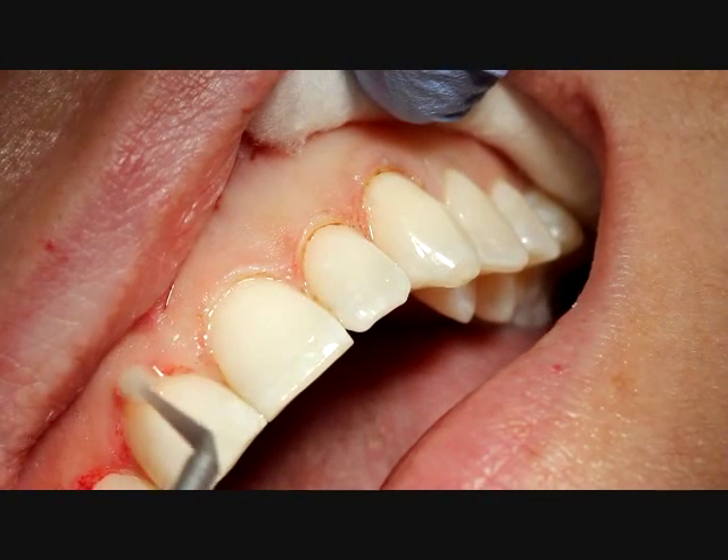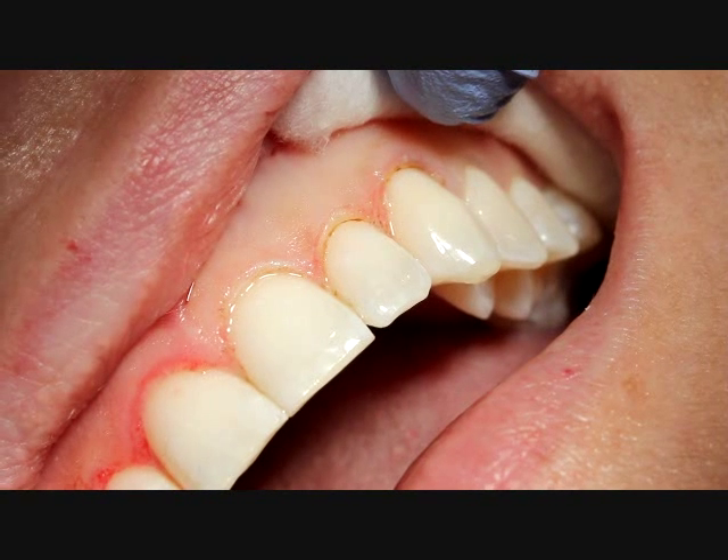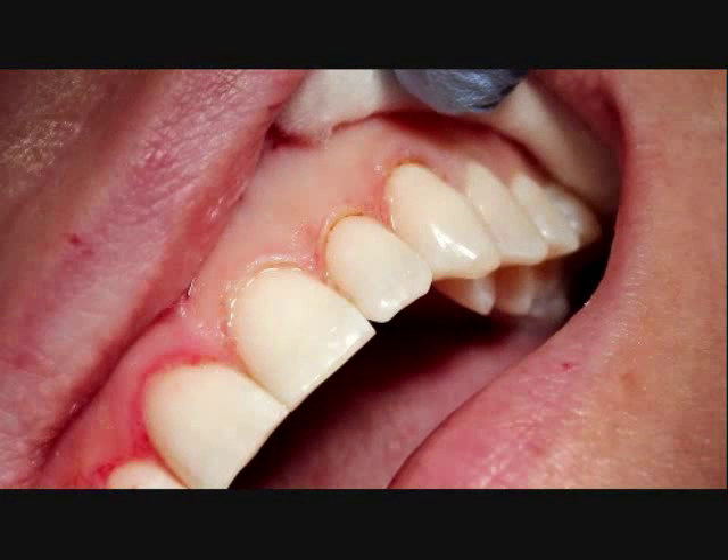As you can see, it gives the tissue a very nice appearance. It doesn't really even look like much was done once we cleaned that up. Now, if you do have a little larger tissue tag, sometimes you can also take a scaler or curette to just remove that as you're doing it. Here we're also going to go over the right anterior teeth which we had done a day prior, and you can see that's healing up very nicely. I would expect this within days to be completely healed.